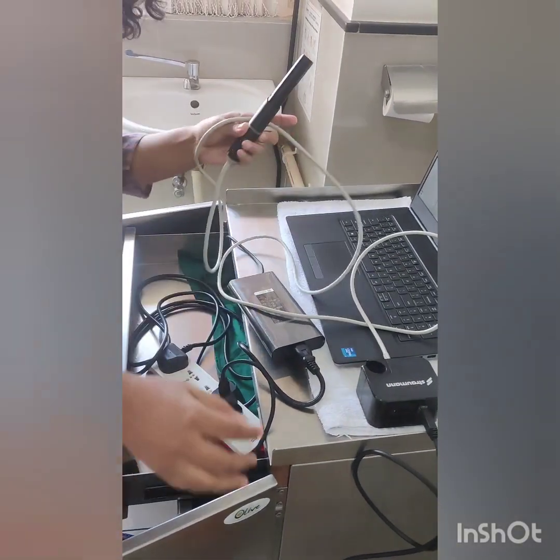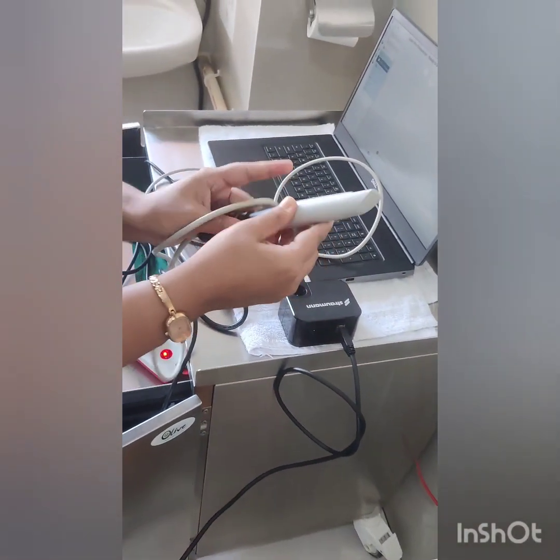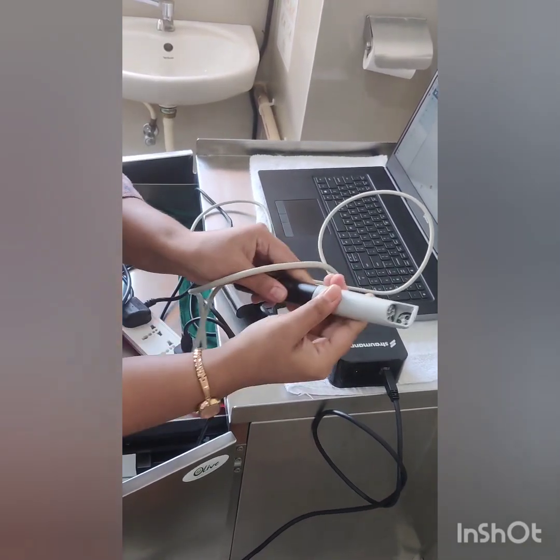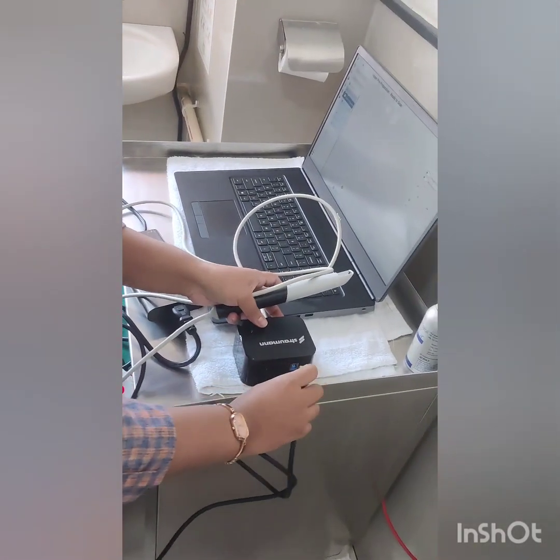So we will start with scanning. Let's put our headpiece onto the intraoral scanning device, also called a wand, and get ready for our patient over to the next session.